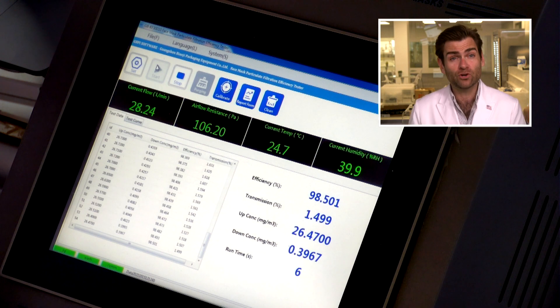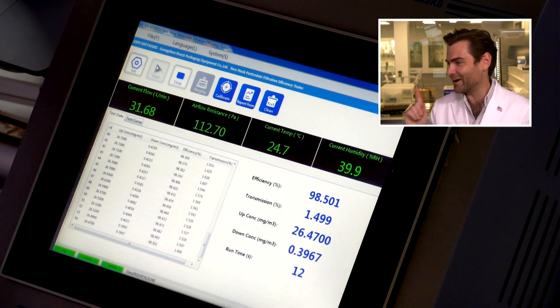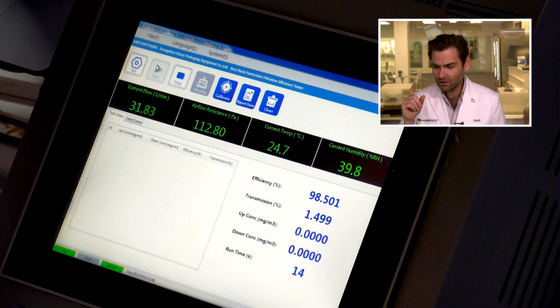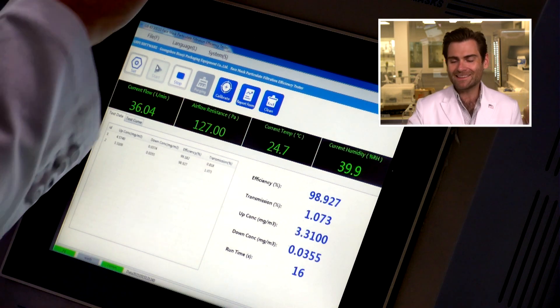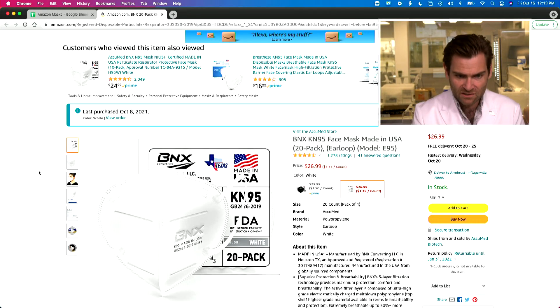This is a PFE machine — a particulate filtration efficiency machine. Check out the link to learn more about how it works. We're basically doing the N95 test, which is almost exactly the same as the KN95 test. We're testing masks so you can figure out if they are safe to use. I just purchased this one on Amazon.